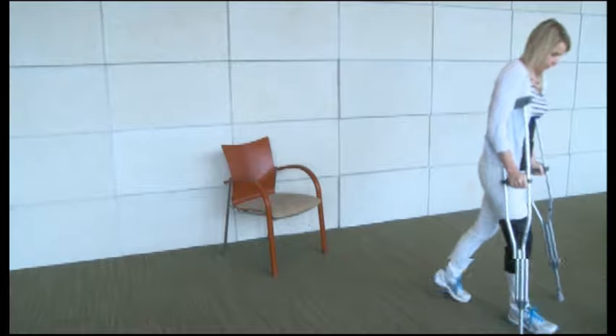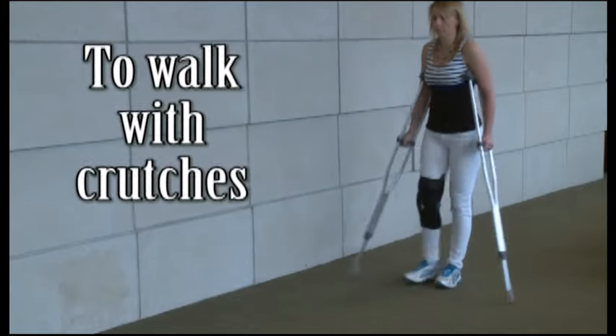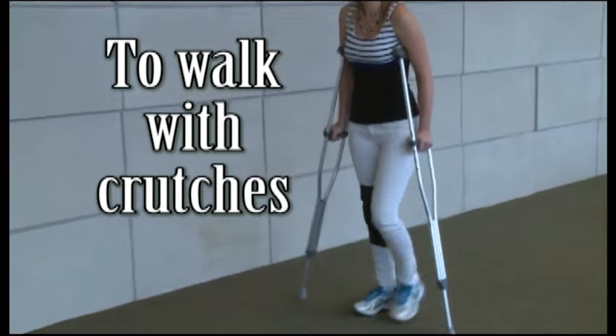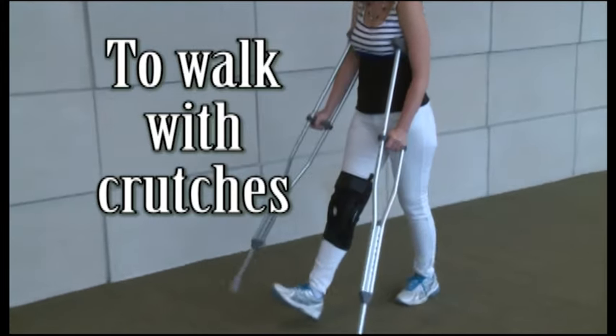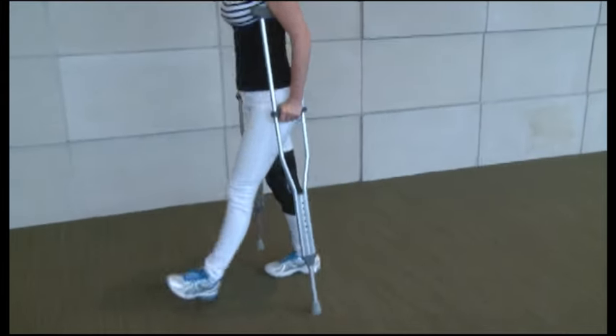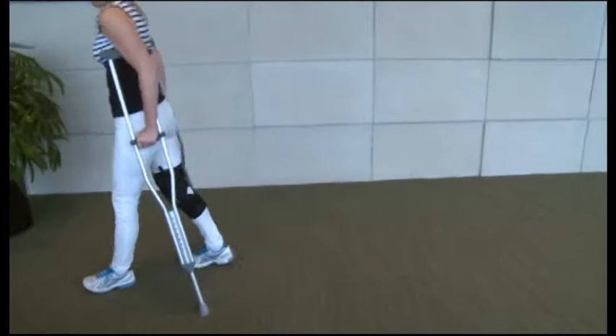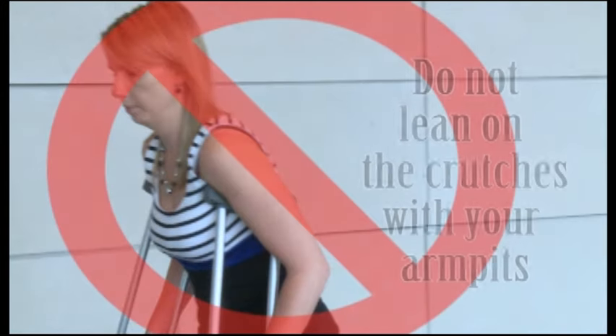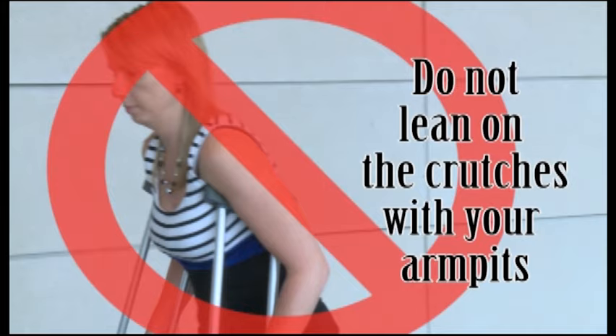To walk with crutches, partial weight bearing. When you walk with crutches, it is important that you keep the crutches under your arms and close to your sides. Squeeze the top of the crutches into your sides while putting weight on your hands and not through your armpits. This is the correct way. This would be incorrect. Do not lean on the crutches with your armpits.